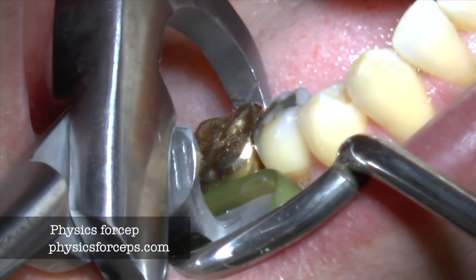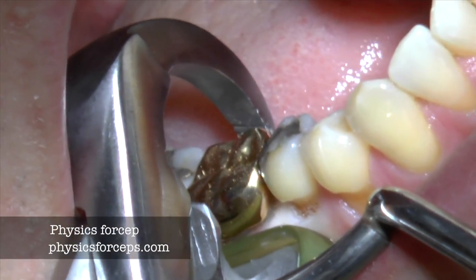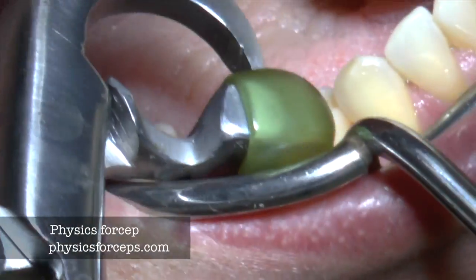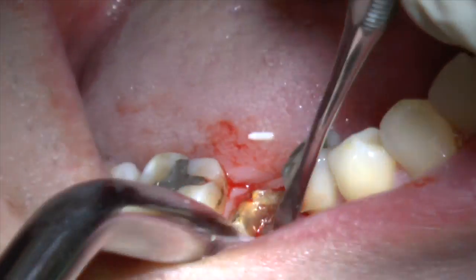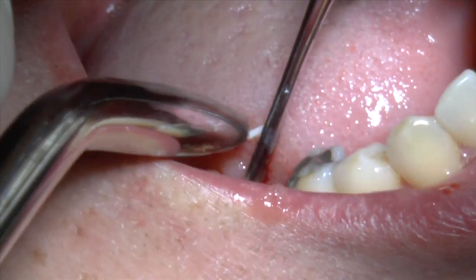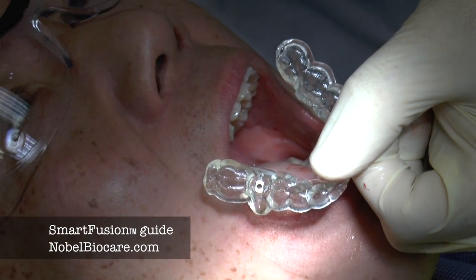It's always important to try the guide before, but here we can't — we have to extract the teeth first. So we're going to extract the teeth; you see the crown comes off, so we go back with the physics forcep and take the rest of the root out, which is a great tool for doing this type of dentistry, because some of these are a little difficult to get out — but this came out quite nicely.